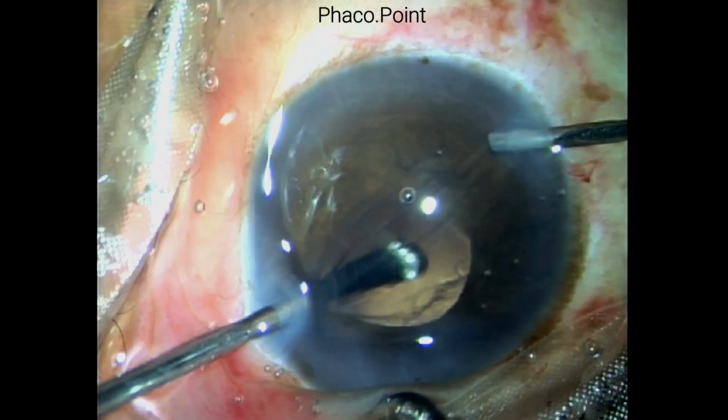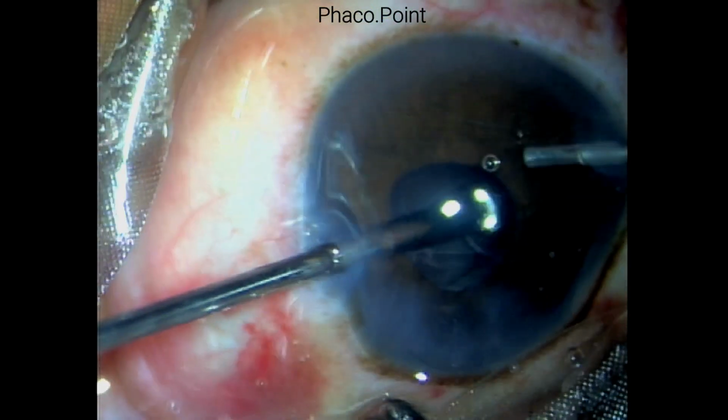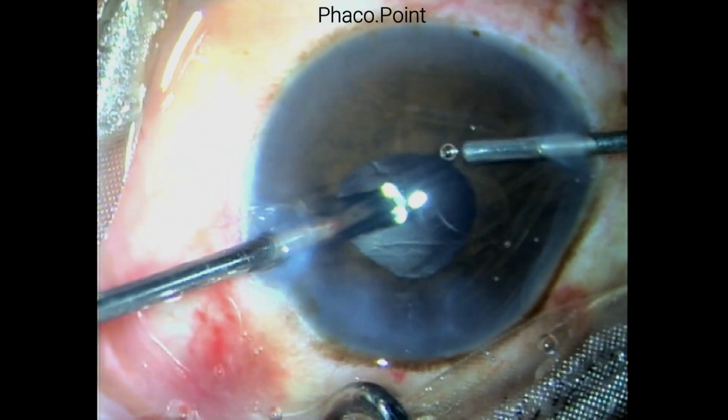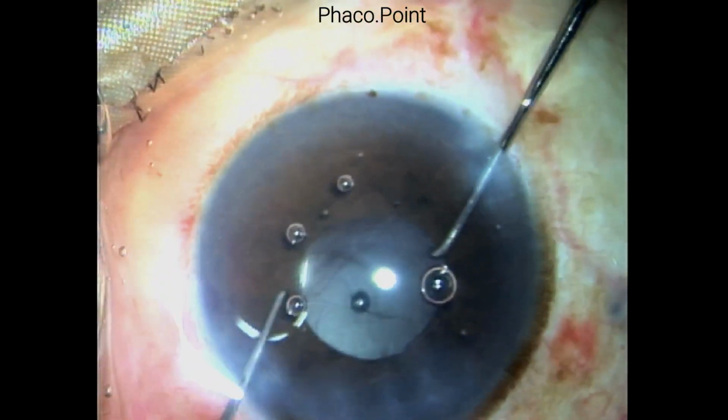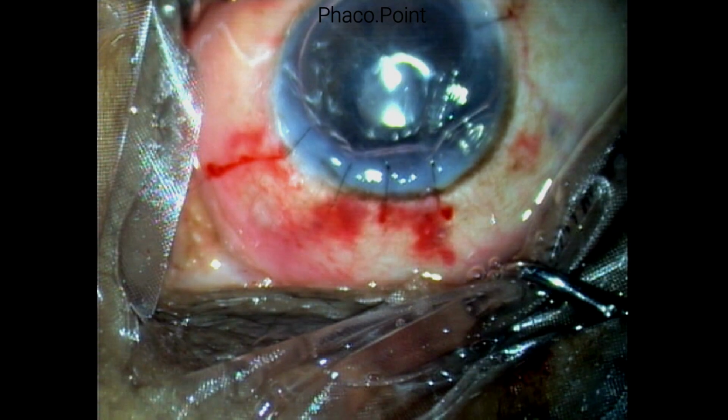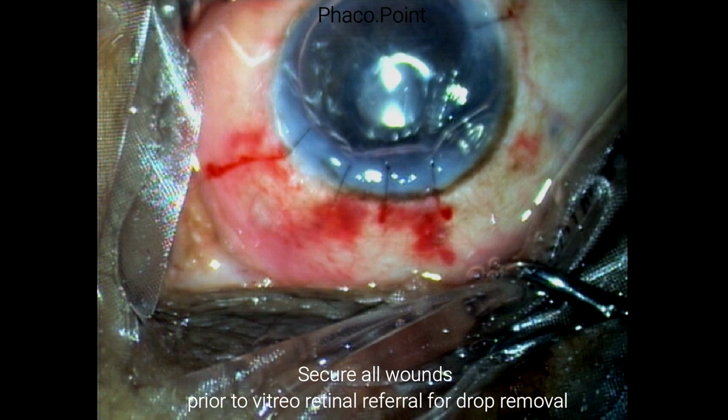Having noticed a vitreous disturbance, I then proceed to performing a limited anterior vitrectomy, after which I place an IOL in the sulcus, close down the incision, and hand the patient over to a vitreoretinal surgeon to perform the removal of the dropped fragment. It's important that we secure the wounds prior to handing the case over to the VR surgeon.